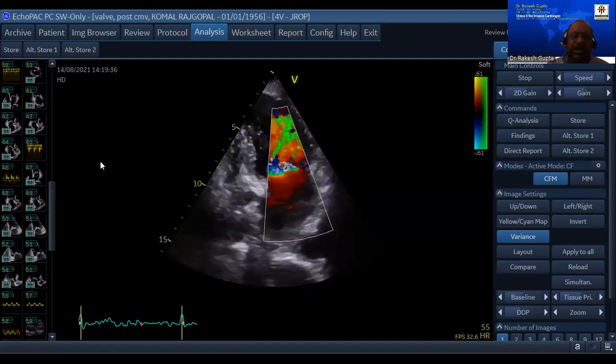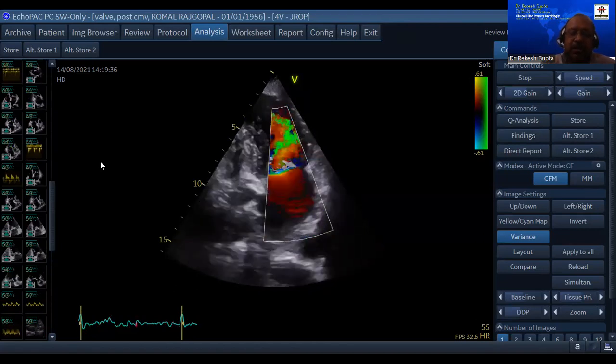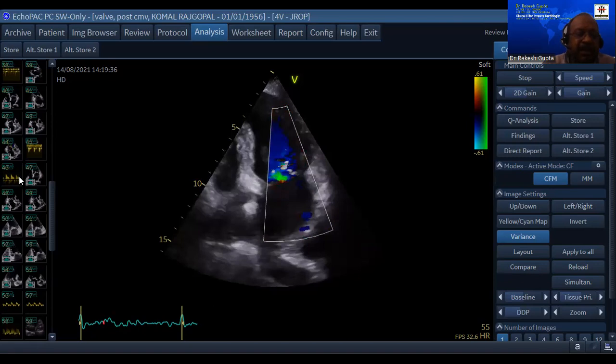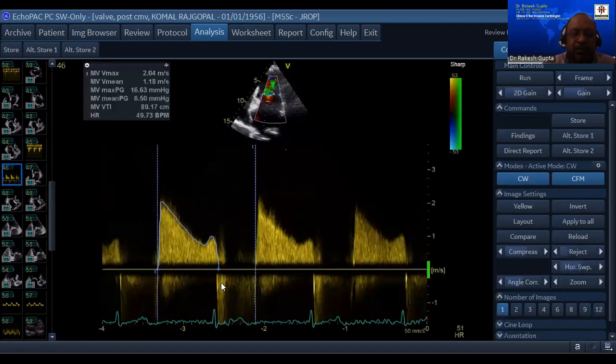Very good question. What exactly happens? I'll put up these people for clinical aspects, whether they are dyspneic, symptomatic or not. And if I'm not really sure what exactly we are dealing with, I put a transesophageal probe inside and look for an exact area. This lady, we did not give any significance when we saw normal sinus rhythm. Imagine somebody who's carrying a normal sinus rhythm, the chances of having dyspnea or being symptomatic is pretty less.